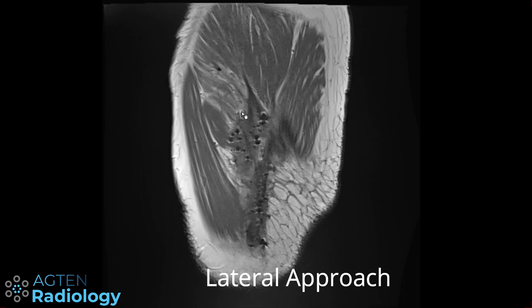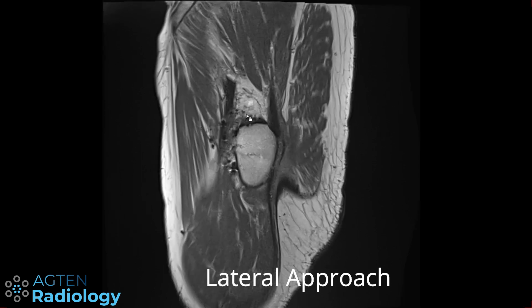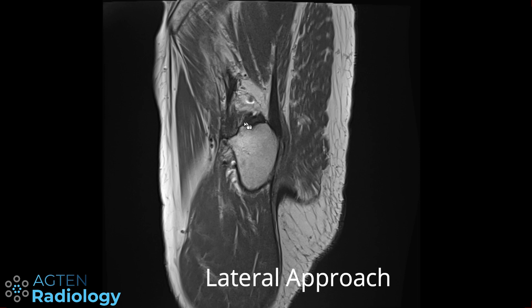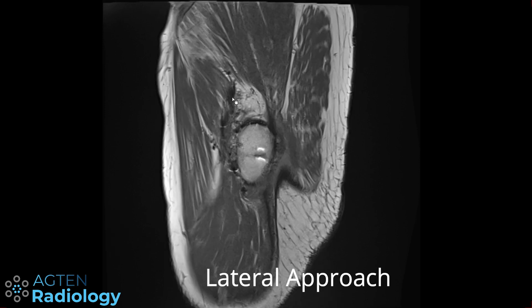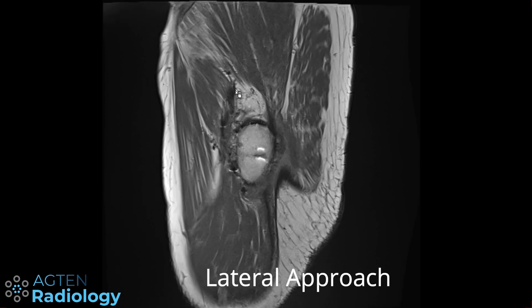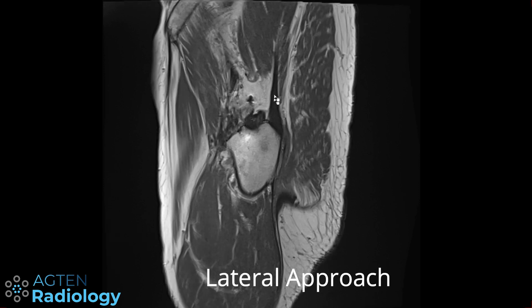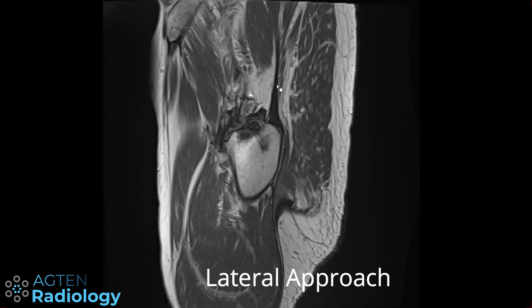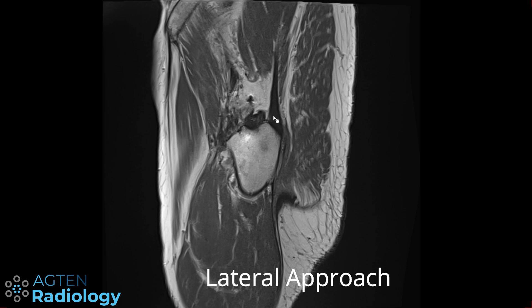You can follow this through and immediately realize why there has to be some damage at the level of the lateral portion of the gluteus medius tendon and also the gluteus minimus tendon, which is severely damaged here. There is a lot of scar tissue and tendinopathy, and the lateral portion is not normal anymore. The superoposterior portion of the gluteus medius tendon, however, is typically intact with this approach.